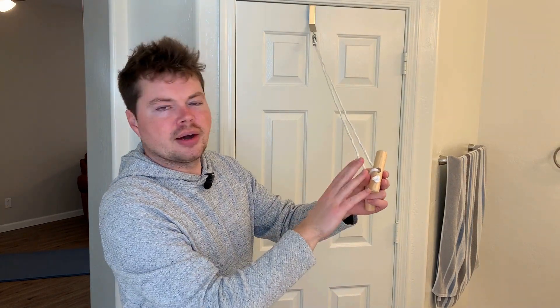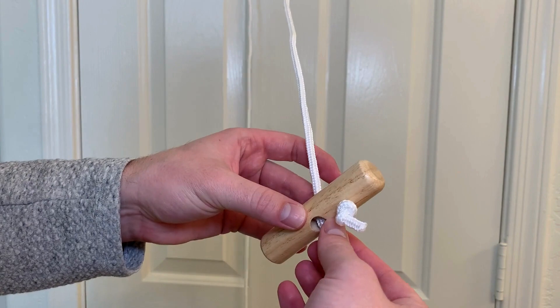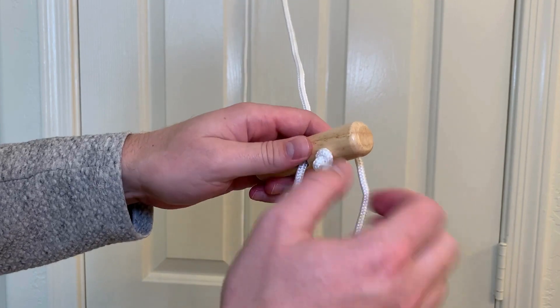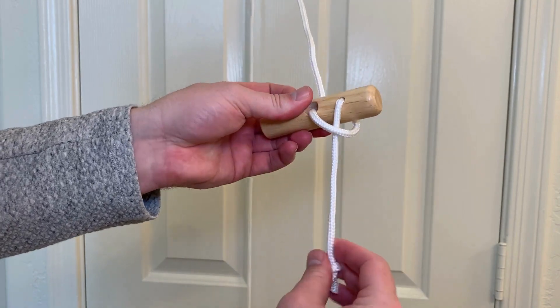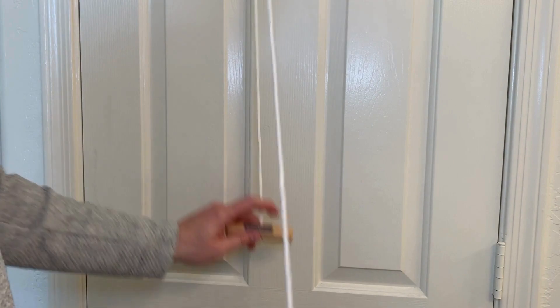Now for the second question: how do you shorten the length of this? It's really easy to do. All you have to do is give it some slack, pull this over, and you can move the knot. Then tie it through like that and pull it tight, and now it's shorter. So you can get whatever length you would like.